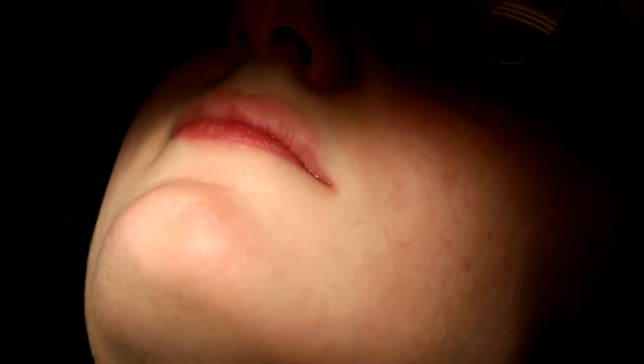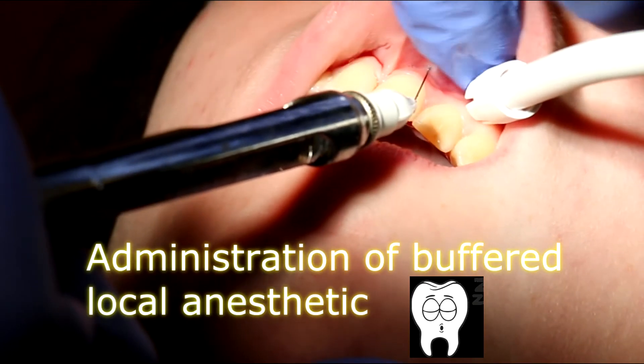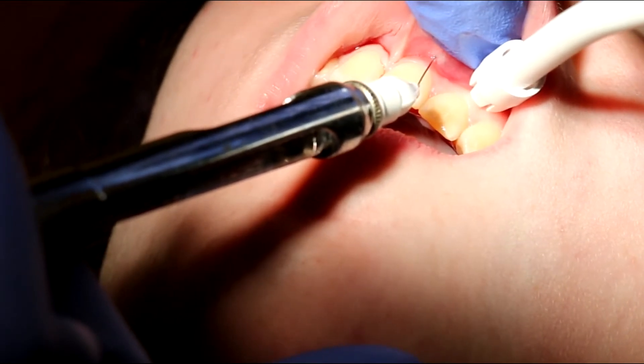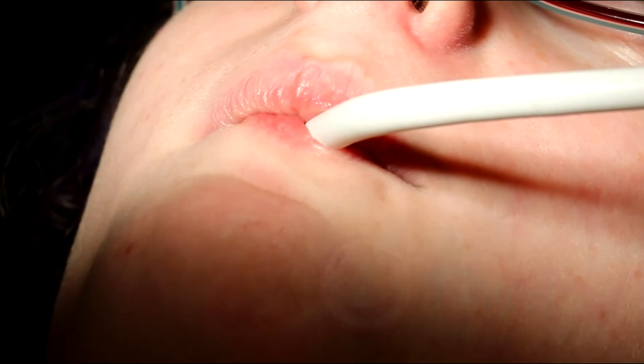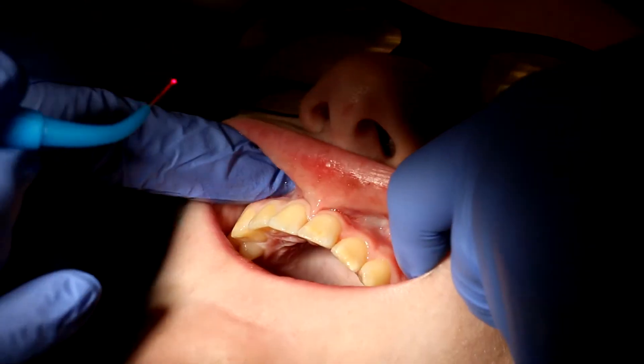Okay, we're going to do the local anesthetic now. You're not going to feel any of this. We buffer it — we change the chemistry right before we inject it, so it's going to be painless. All right? Good. Did you feel any of that? Good. You're feeling nice and numb? Okay. So we're going to get started. You're not going to feel anything. You can just watch the TV on the ceiling. Just relax. Move your chin down a little bit like this. That's great.